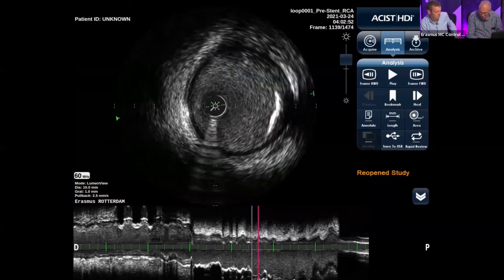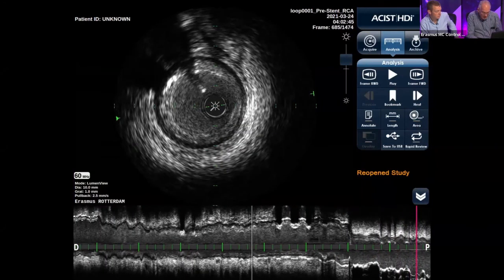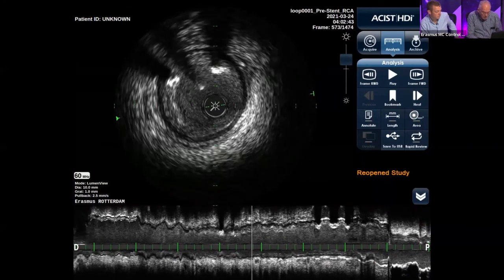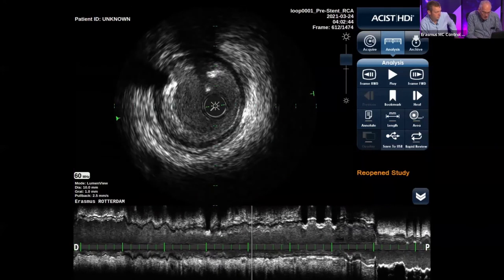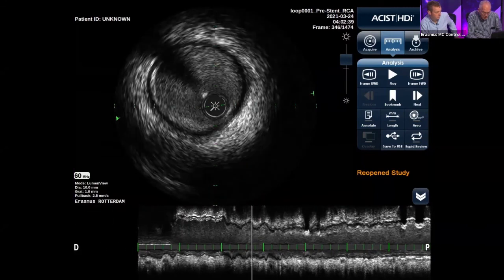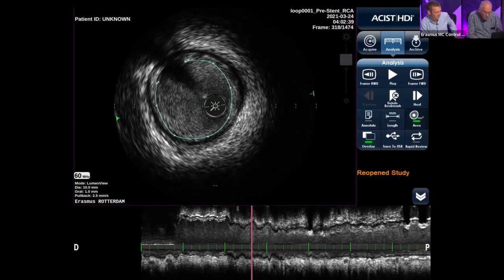Now we go distal. And I suggest that we land up in here. We go more distal. We want to cover this spot here, and I think this is a very nice landing zone. I will quickly do this because I think that we're running out of time. Well, time is flying when we have fun, isn't it? And then we have here 4.09.